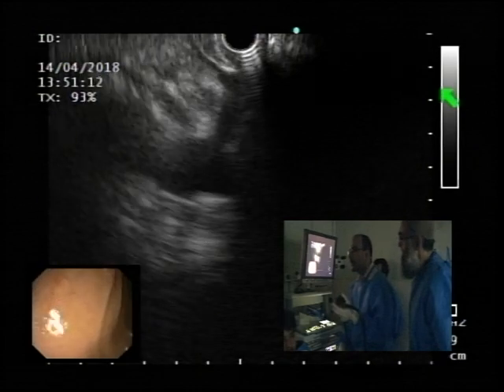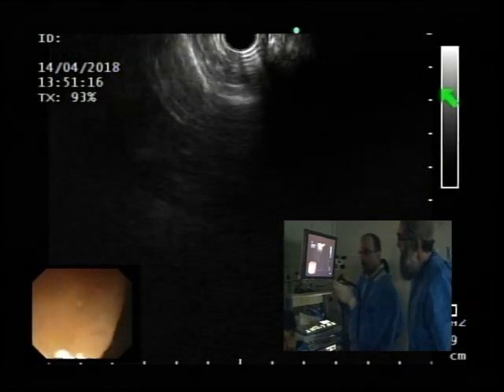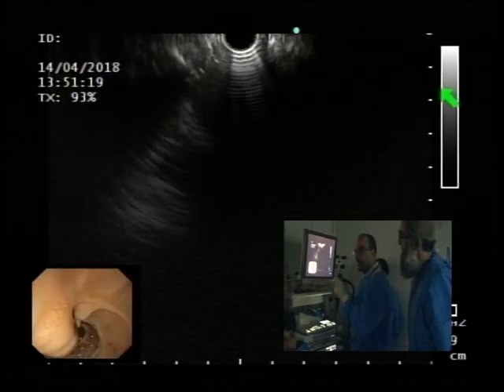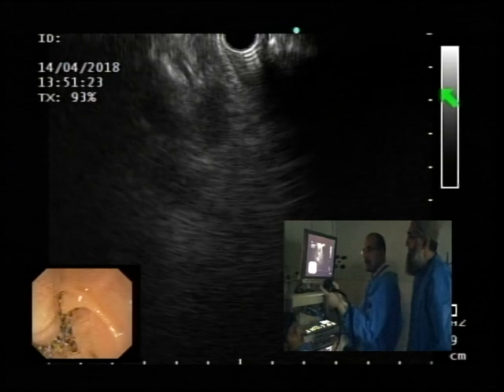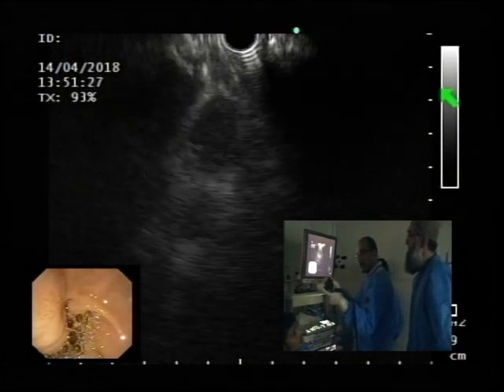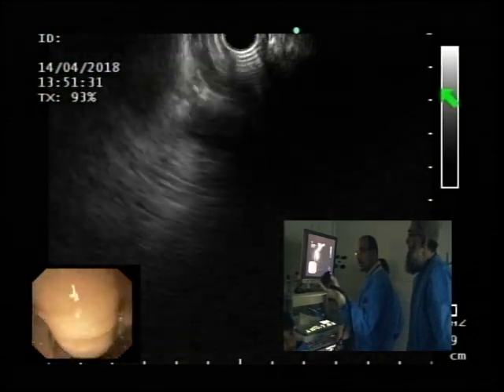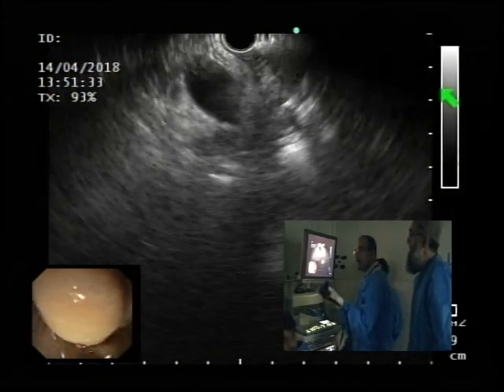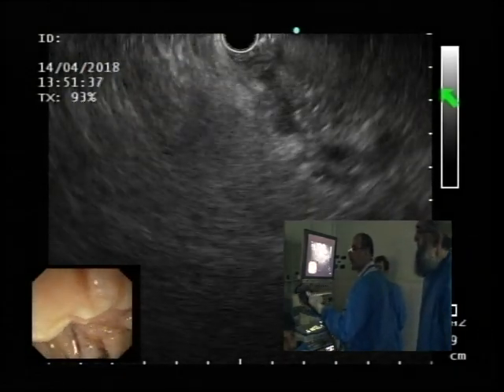To get into the second portion, of course there may be compression. So thumb down, small wheel to the right, suction, and like ERCP I keep my thumb down so that my probe doesn't go through the back wall, and I'm just going to gently pull my scope back. It's a very prominent papilla, which could be an ampullary lesion as well. Let's enlarge the endoscopic view a bit.